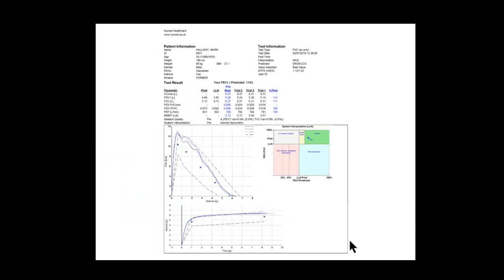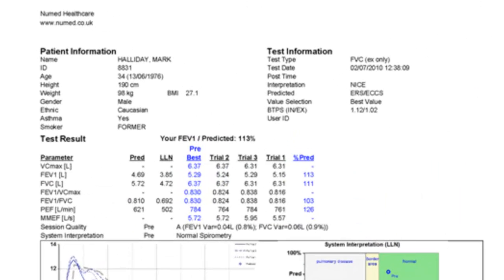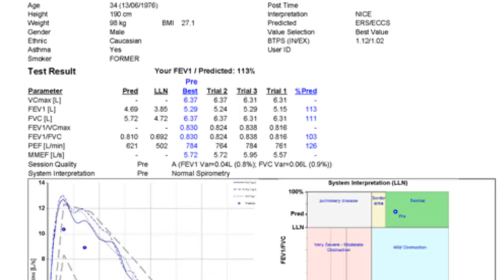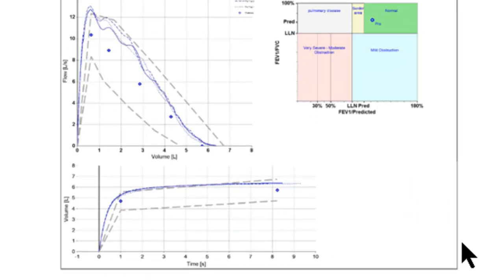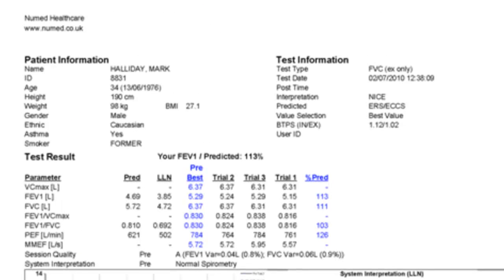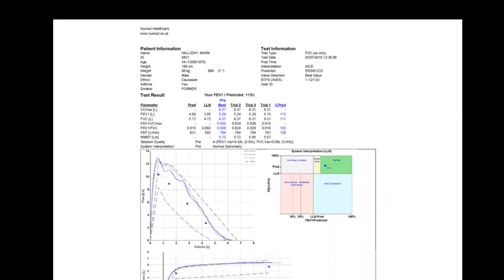The PDF can obviously be sent electronically and reviewed on anybody's desktop throughout the practice. It's got the interpretation on, all the graphical information, and it will show all of the post bronchodilator results as well giving us percent changes.